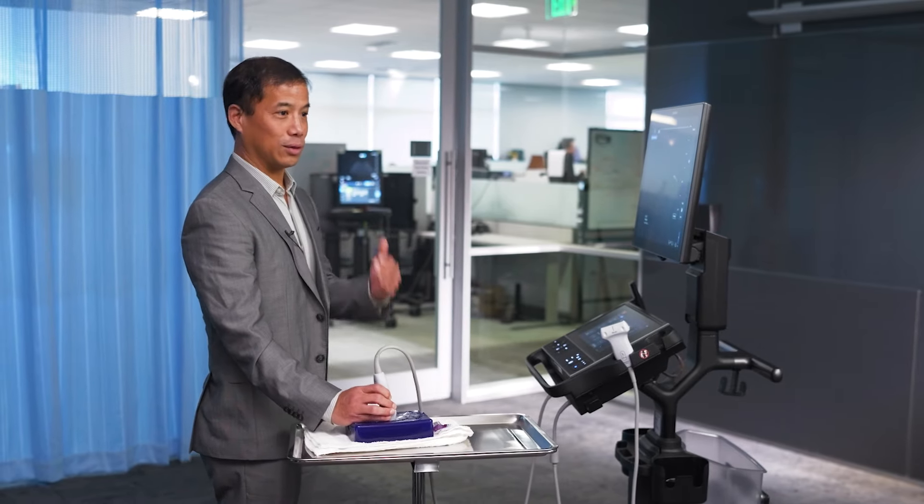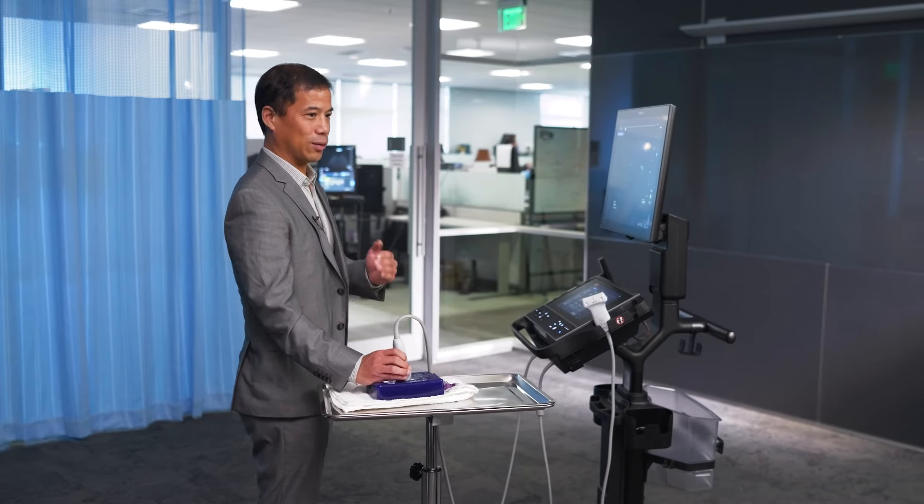You can't do your job without an ultrasound that works. This is the one that just keeps working and working and working, day after day, year after year. Let's just play around with it.